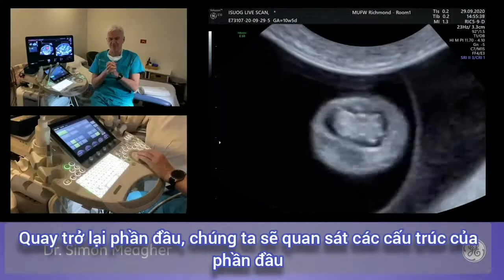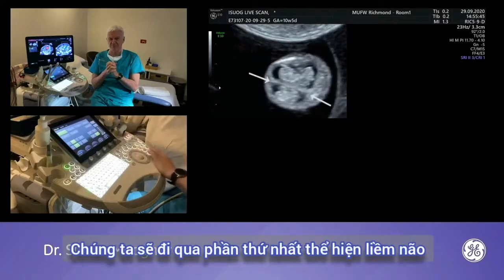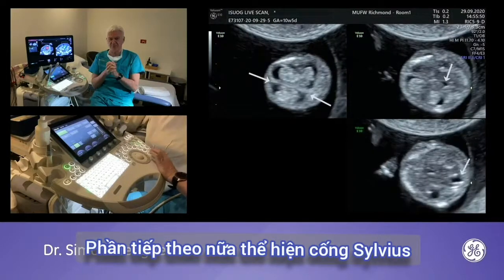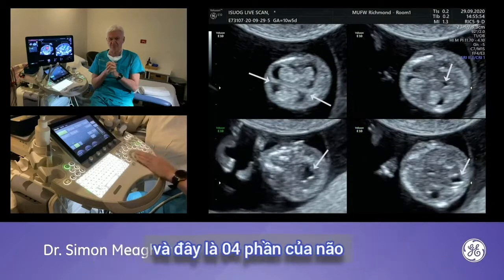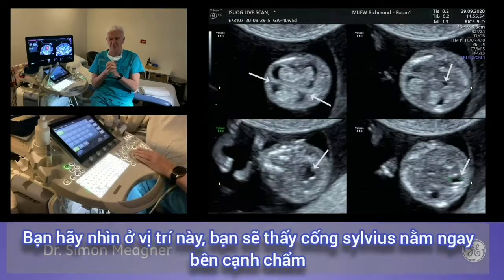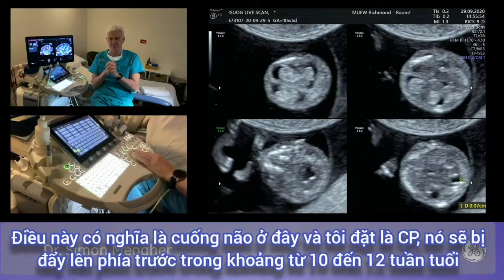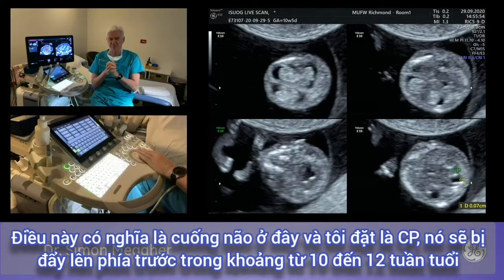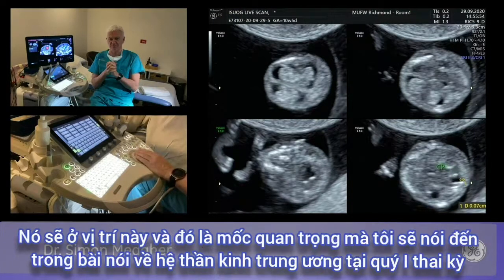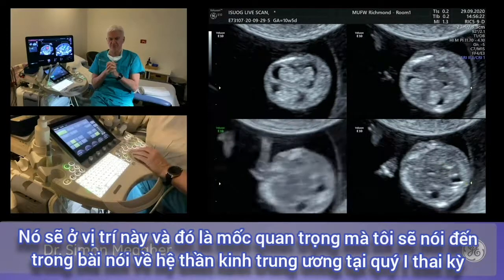Back to the head: the sections of the head can be divided into four. The first section shows the falx. The next shows the third ventricle. The next shows the aqueduct of Sylvius. The fourth section shows the fourth ventricle. These four sections look very different to the four sections of the brain at 12 to 13 weeks. The aqueduct sits right beside the occiput; the cerebral peduncles get pushed forward between 10 and 12 weeks — an important landmark to be discussed in the first trimester fetal brain talk.